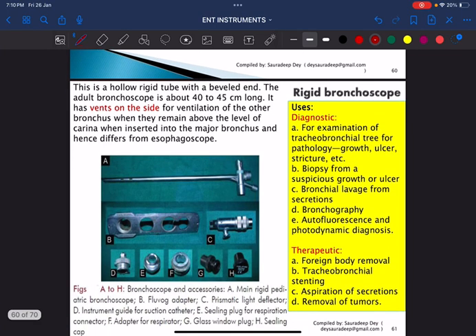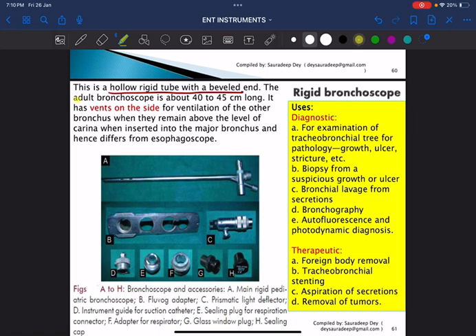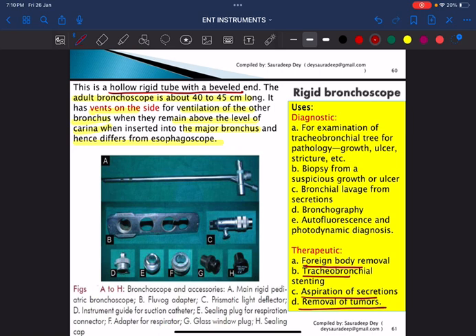This is the rigid bronchoscope — a hollow rigid tube with a beveled end. The adult bronchoscope is 40 to 45 centimeters long and has vents on the side for ventilation of the other bronchus when inserted into a major bronchus. This distinguishes it from the esophagoscope, which does not have vents. It is used for diagnostic and therapeutic purposes: foreign body removal, tracheobronchial stenting, aspiration of secretions, removal of tumors, and biopsy.